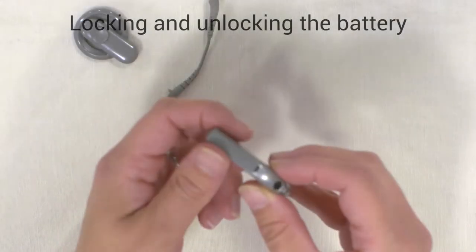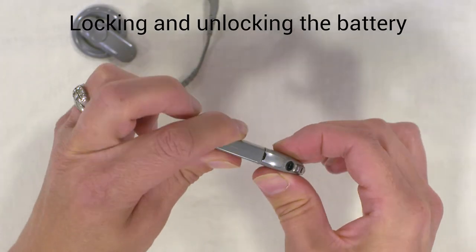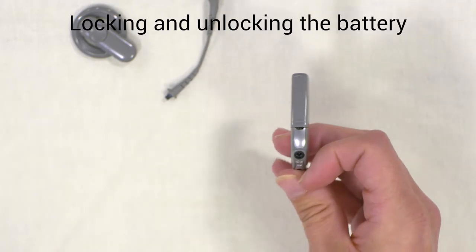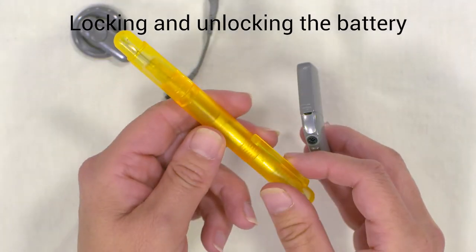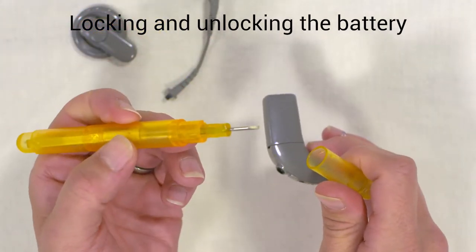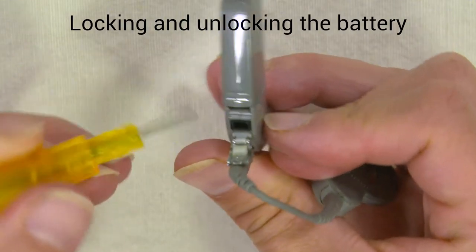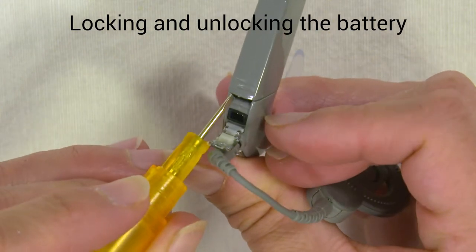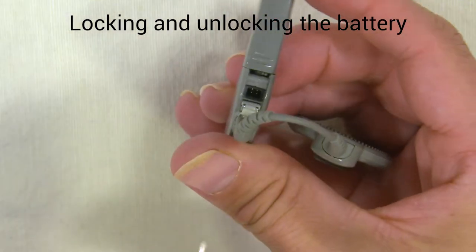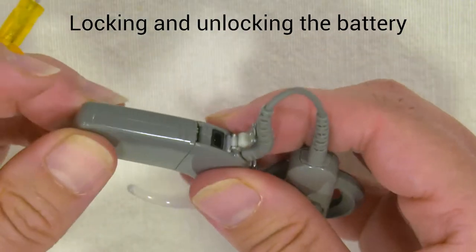For small children, if you're worried about the battery being taken on and off, you can lock the battery onto the processor. In your kit when you get the processor, you should have one of these pens which on the end has a screwdriver. You can lift the flap here and at the base there's a silver lever that you push across, and then the battery is now locked.